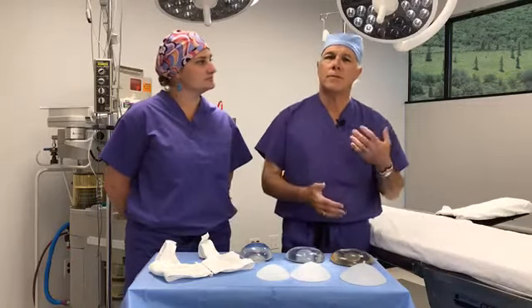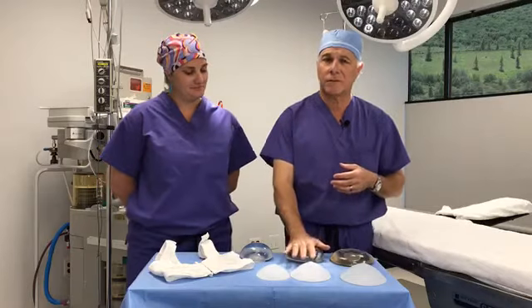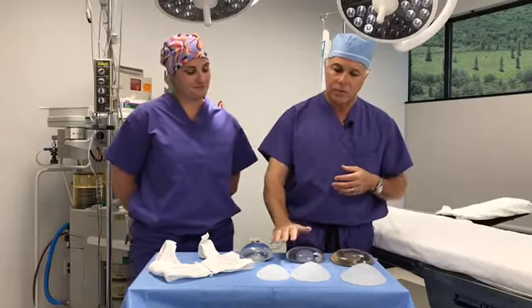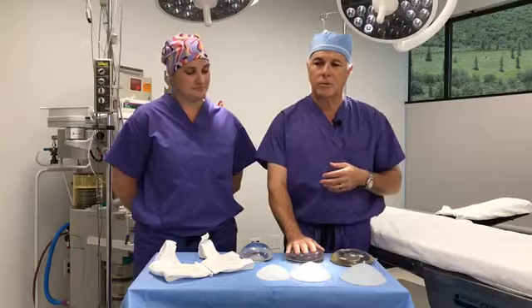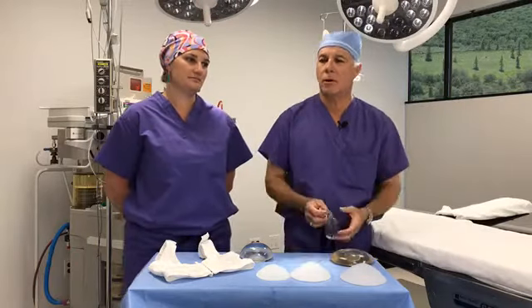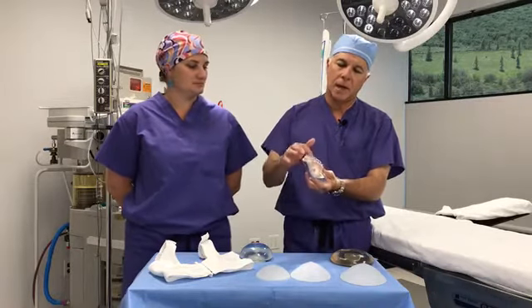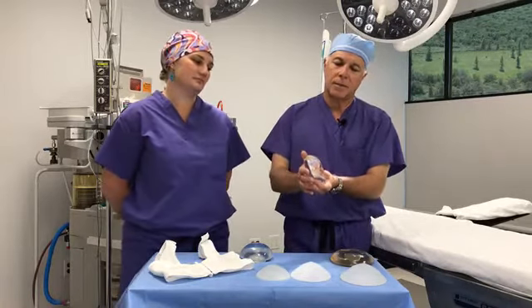Once you go through the differences between the two, most patients are going to choose the silicone implant because it's going to feel softer, it's going to lay smoother, and it's going to look more natural. It also has less of what patients call rippling, we call fold flaws, which you can see when you take an implant and turn it on its side, it has a tendency to have some of these ridges.